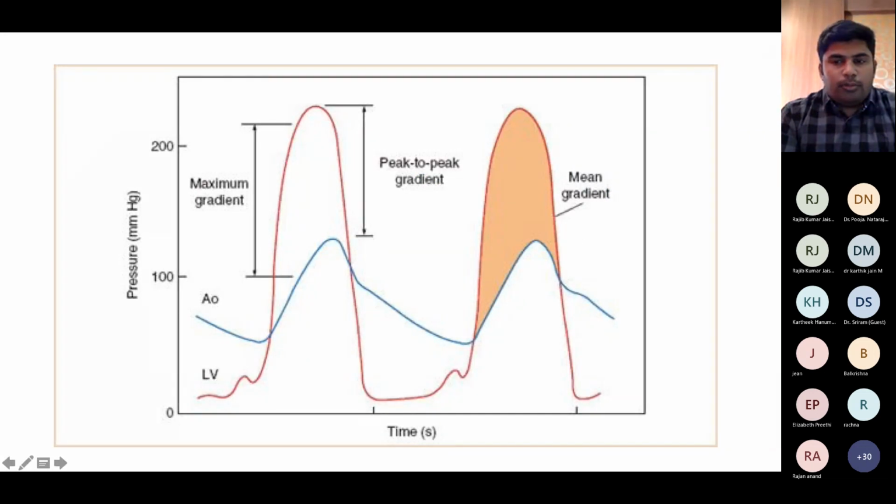Now we know how to measure a pressure difference between 2 points. The pressure we get is the relative pressure, not the absolute pressure. So it can be employed to measure the pressure gradient between any two areas. For example, in aortic stenosis, the LV pressure is more than the aortic pressure. By the time we measure the peak aortic velocity, the peak velocity in the LV is already over. So when we measure this instantaneous gradient, we won't get a peak-to-peak gradient.